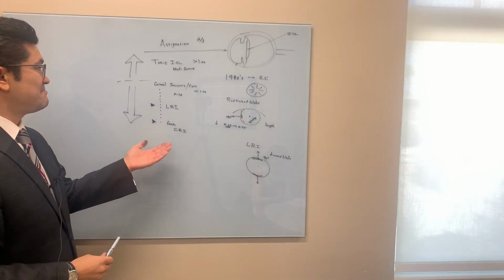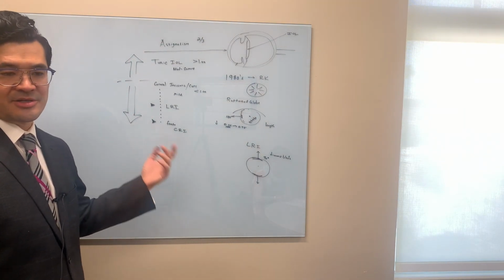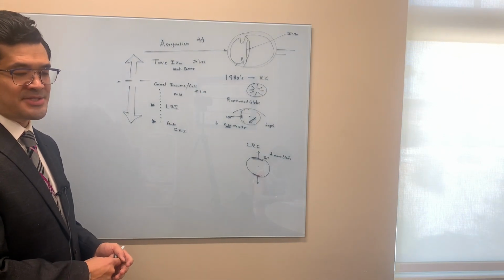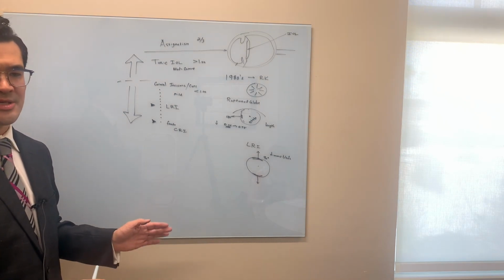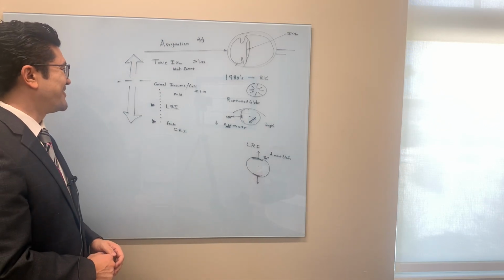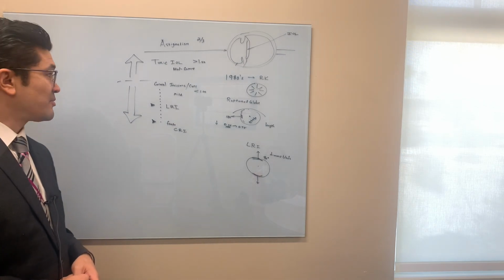And actually, if there's less than 0.5 or almost 0, you don't need to do any of that. You can just do regular cataract surgery. Generally speaking, the tolerance for the multifocal lens, you do want it less than 0.5 cylinder when you're all said and done, if you can. And those are going to be the happiest patients, or ideally 0. But the happiest patients are less than 0.5 on the cylinder, and they'll get to that good vision afterwards.